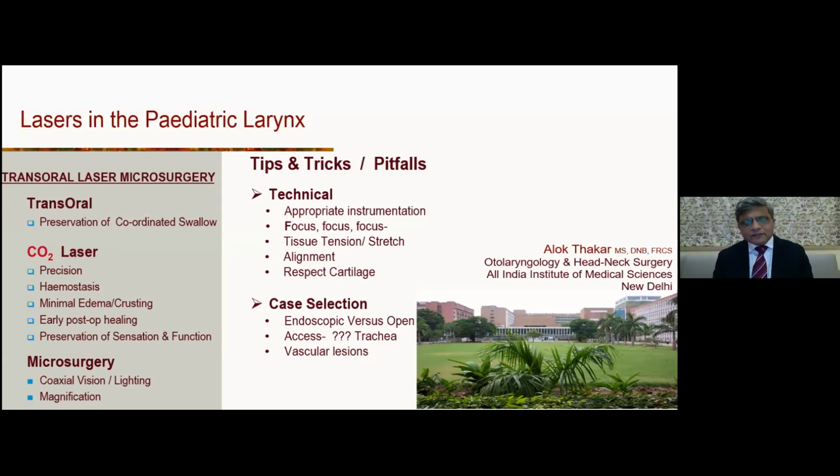Laryngeal clefts are some of the undiagnosed reasons for repeated aspiration and airway stenosis, and that is maybe another indication for using a laser in the larynx. I have used a laser for accidental corrosive poisoning. So there is always a supraglottic stenosis, and again a fiber transmissible laser like a KTP or diode can be used for these lesions.